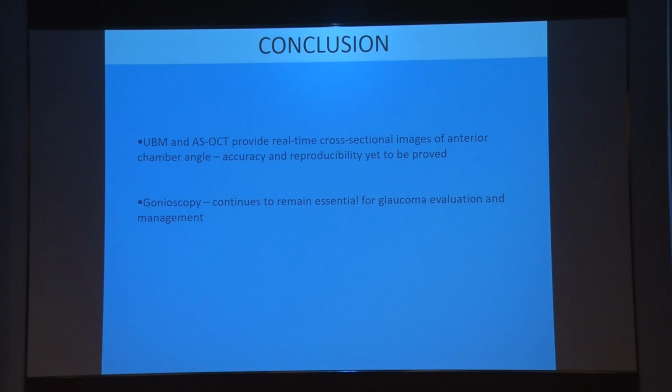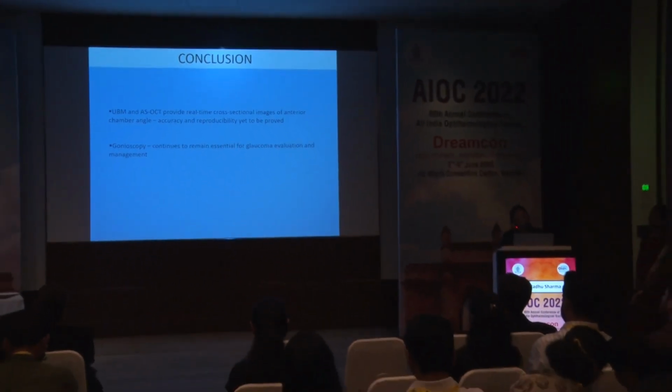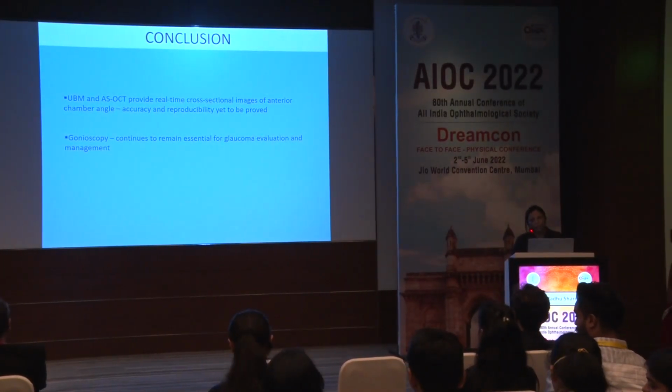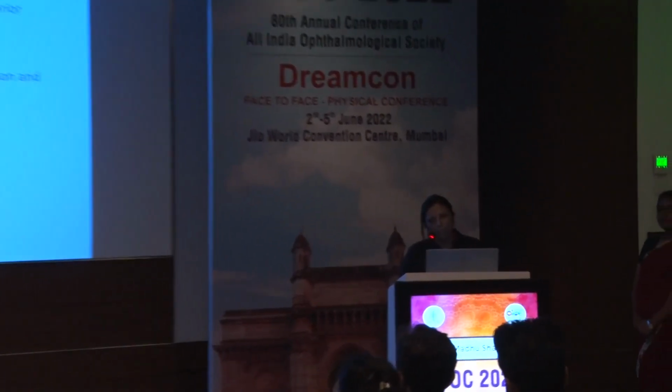yet to be proved. Gonioscopy remains and continues to be the essential tool for assessment of the angle in diagnosing glaucoma. And I'd like to leave you with the message that please do not diagnose glaucoma or write any anti-glaucoma medication without doing a gonioscopy. Gonioscopy is a must for diagnosing glaucoma. Thank you very much for your attention.